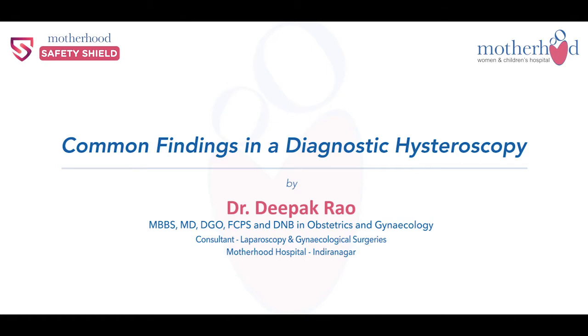A diagnostic hysteroscopy is a procedure where a thin telescope attached to a camera is inserted through the vagina, through the cervix, which is the mouth of the uterus, into the cavity of the uterus to examine the cavity of the uterus to look for abnormalities. The most common indication for a diagnostic hysteroscopy is abnormal uterine bleeding. It could be heavy uterine bleeding, prolonged uterine bleeding, intermenstrual uterine bleeding.